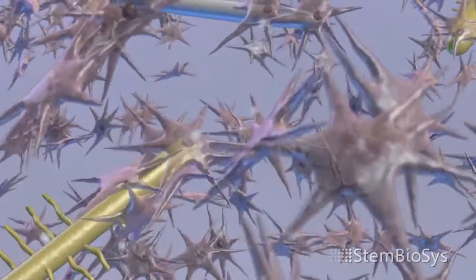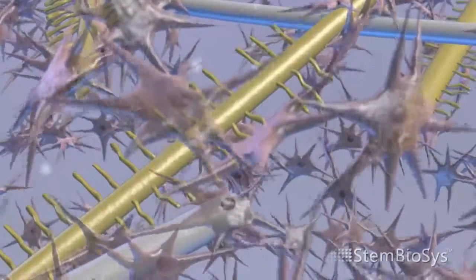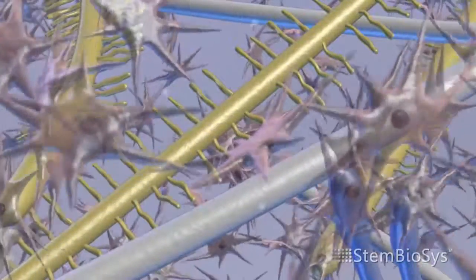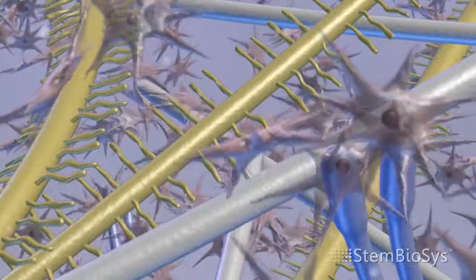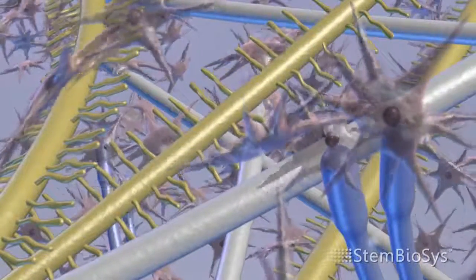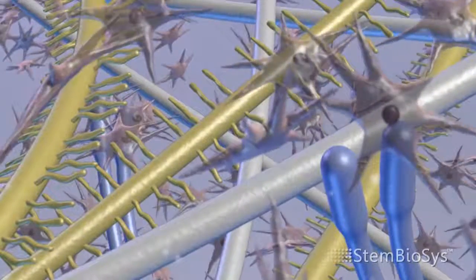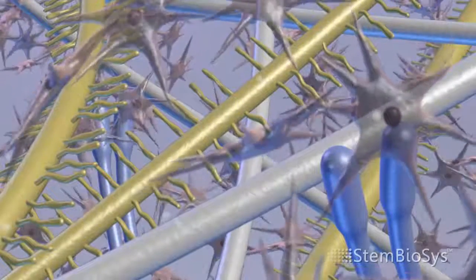The cells are then stimulated to produce an extracellular matrix. These matrix proteins are deposited in a defined and ordered three-dimensional structure, a home built by the bone marrow cells in a fashion similar to what they do in their native bone marrow. This extracellular matrix is a complex, multi-protein composite that mimics the natural bone marrow niche for stem cells.